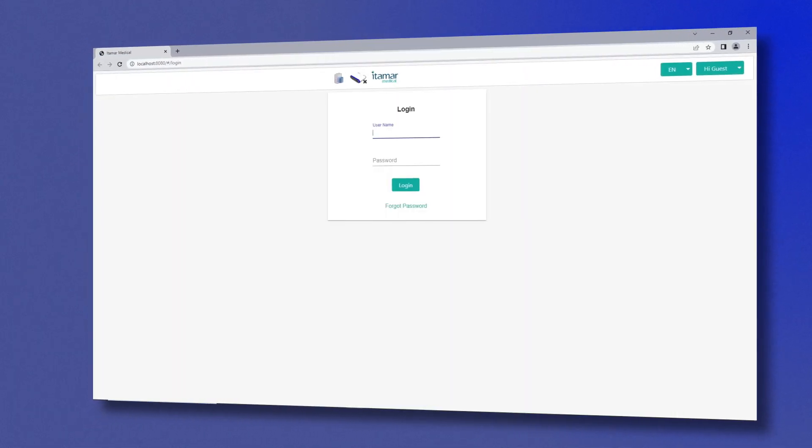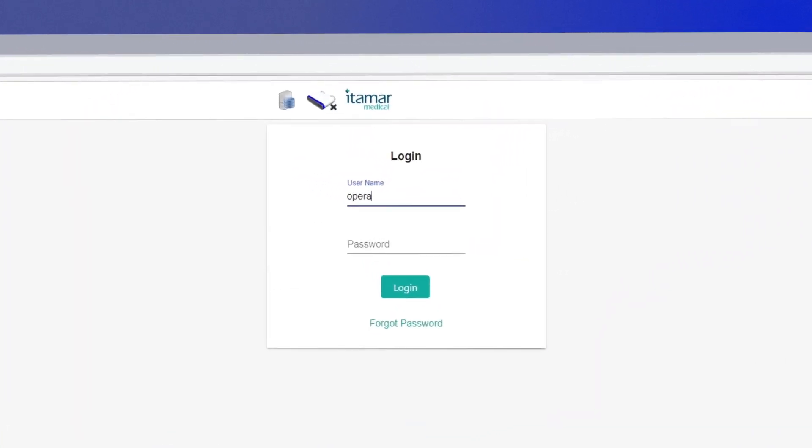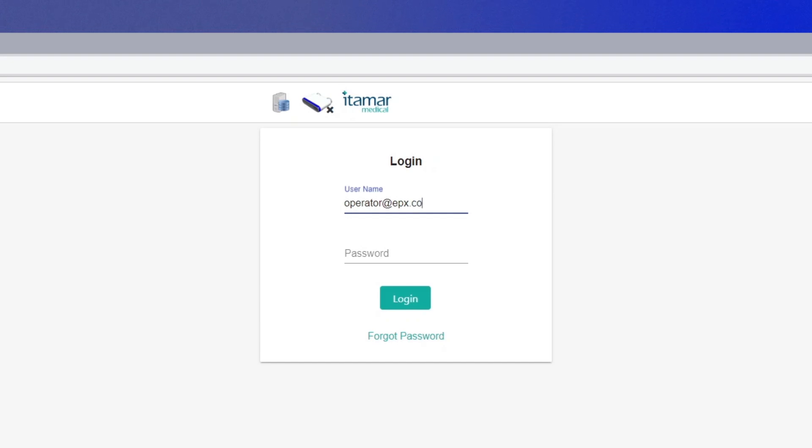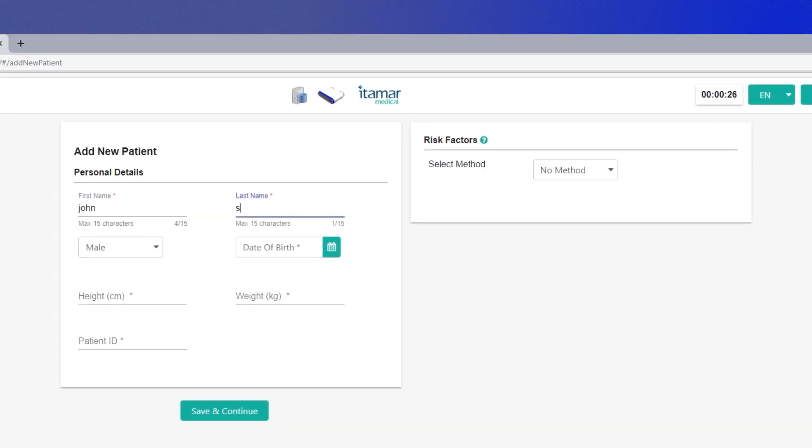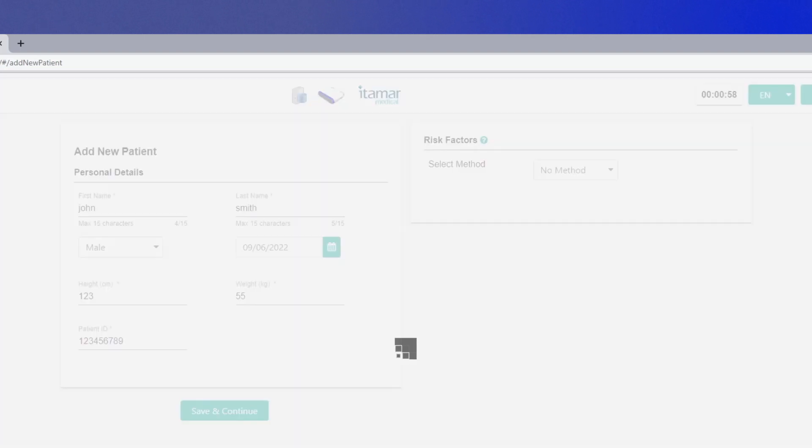Activate the EndoPAT application by clicking on the icon. Enter your username and password and press login. Make sure there is a connection between the device and the computer. Select Add New Patient or select from a list of existing patients. Enter patient details as required. You may choose a risk factor method of display. Click Save and Continue.